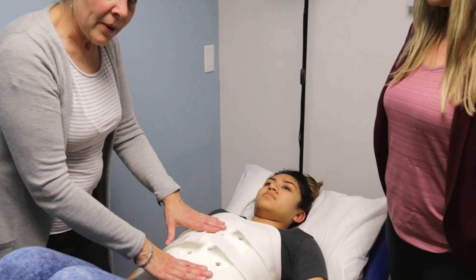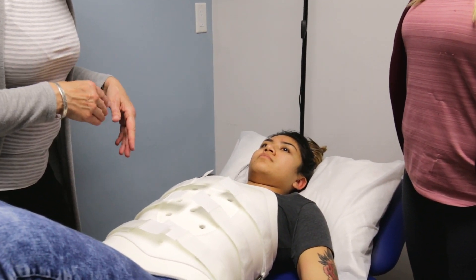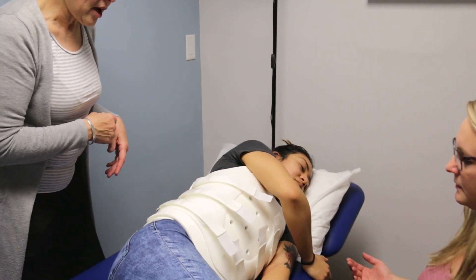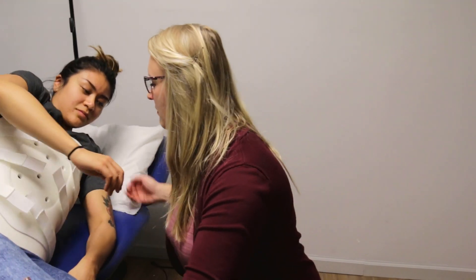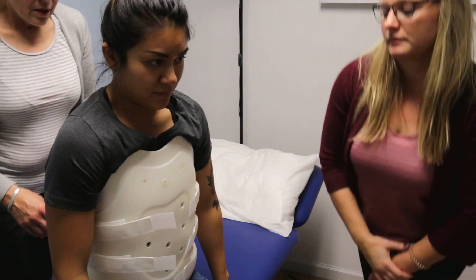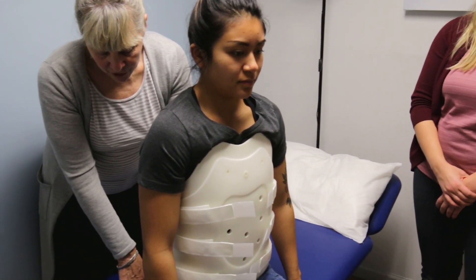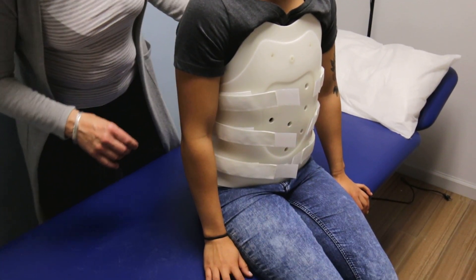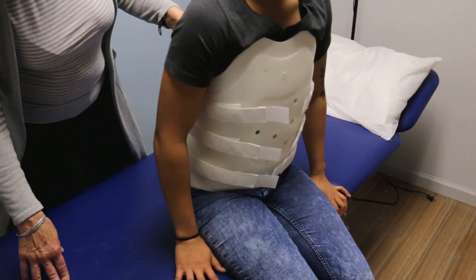Once you've got the front and back all clamped together, we're going to do a side log roll and get the person up. Rolling on your side with your knees up, knees over the edge like a teeter-totter, pushing up on your elbow, and sitting up. Make sure we're not pushing too far down into soft cushions or a soft bed or couch, and that the brace isn't digging in too much.